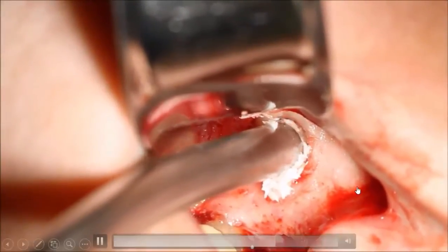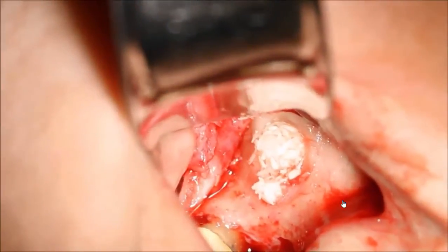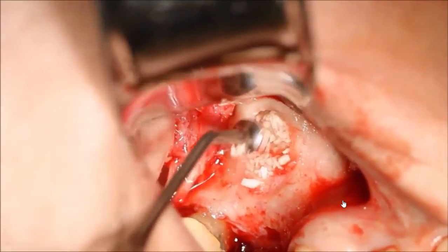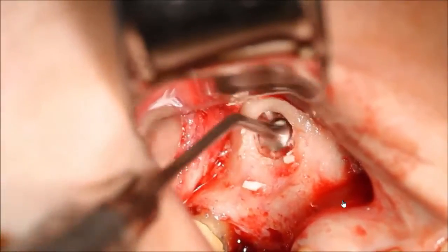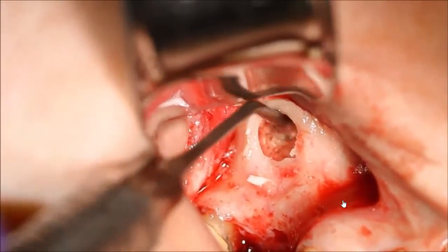هون هلا مثل ما شايفين بلشنا نحط البون graft. Here I was using the allograft. It's FDBA allograft using large particle size. The particle size here is 1 millimeter. طبعا there is also small particle size FDBA.